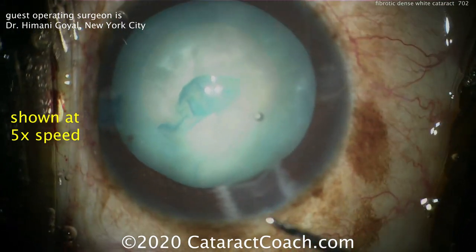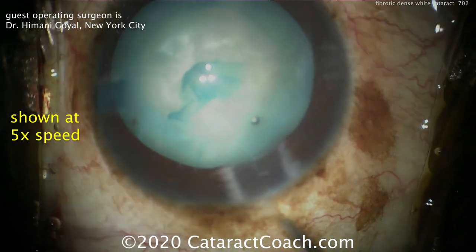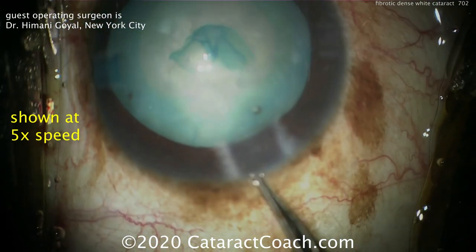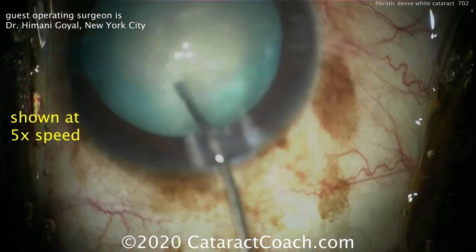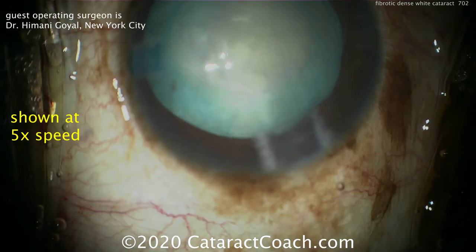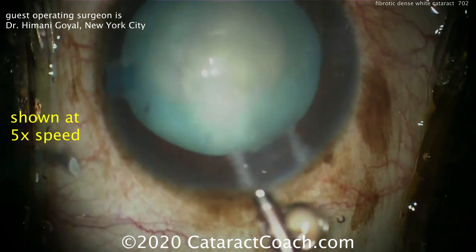This is a type of white cataract where there is hardening of the lens cortex, and it becomes adherent to the capsule — not only the anterior capsule, but in this case also adherent to the posterior capsule, or even the lens capsule bag equator all around the capsule.